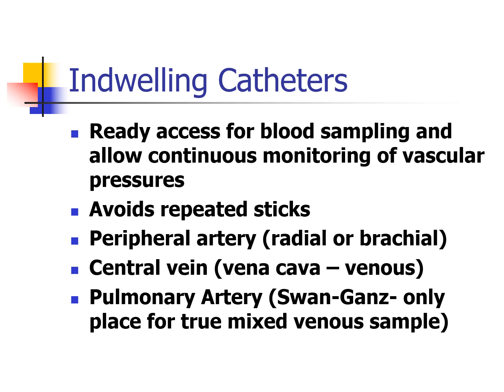Central catheters, the central line, they're usually in the superior vena cava, either subclavian or jugular, IJ, EJ. And so this is good if you want to do a VBG to look at pH and CO2 or how much change there is. If you have to do a shunt equation, and we don't have a pulmonary artery catheter, the Swan-Ganz, right? So if for some reason we do not have a Swan-Ganz in place, then you can easily draw from the central vein. It's the closest place to the lungs, and still do a venous blood gas, an arterial blood gas, and then do all your shunt equations from there.